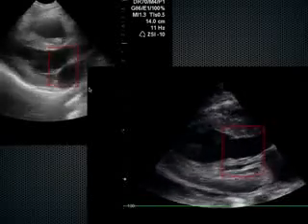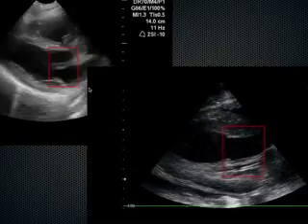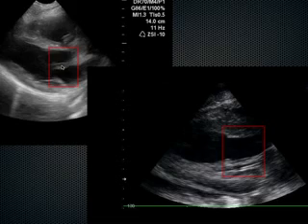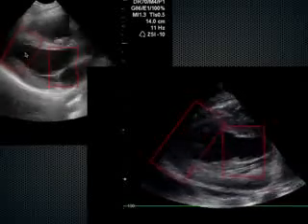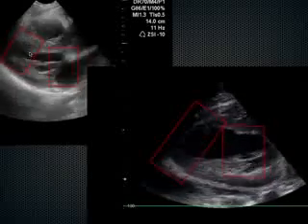I'm going to freeze this a little bit and show you how that happens. Boom, right there. See that? See how that mitral valve right up here smacks that septum? See how I'm doing that? I'm kind of going frame by frame here to show you that. That's normal. That's what you want to see. Okay? Now, let that play, and then I'm going to look over here at the interventricular septum and posterior wall. Pretend you're a little red blood cell sitting right here, and you would get squeezed right out the aortic outflow tract, right? Because these two things are compressing, squeezing you right out the aortic outflow tract.